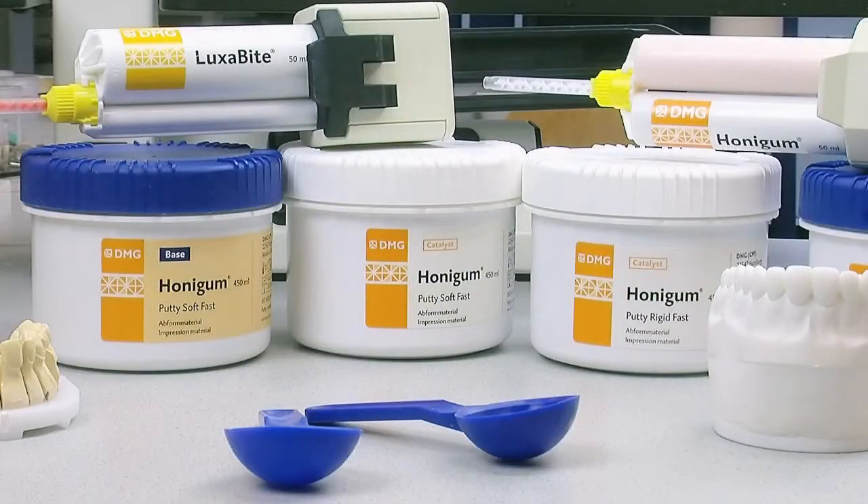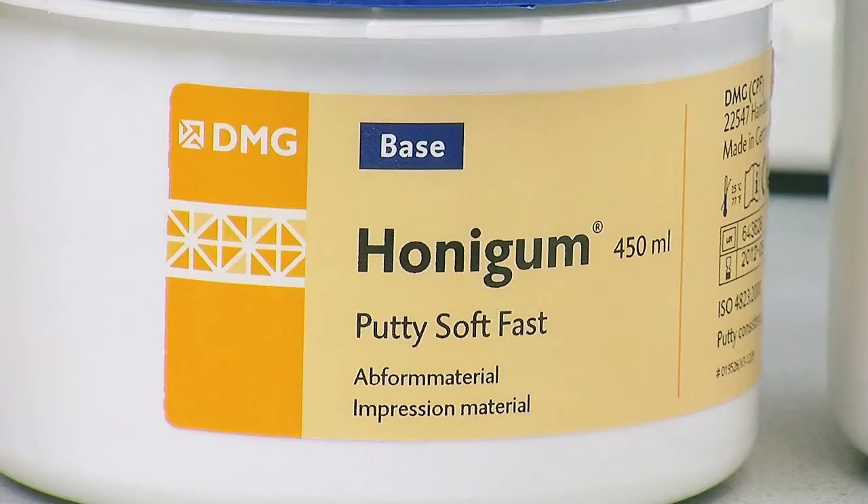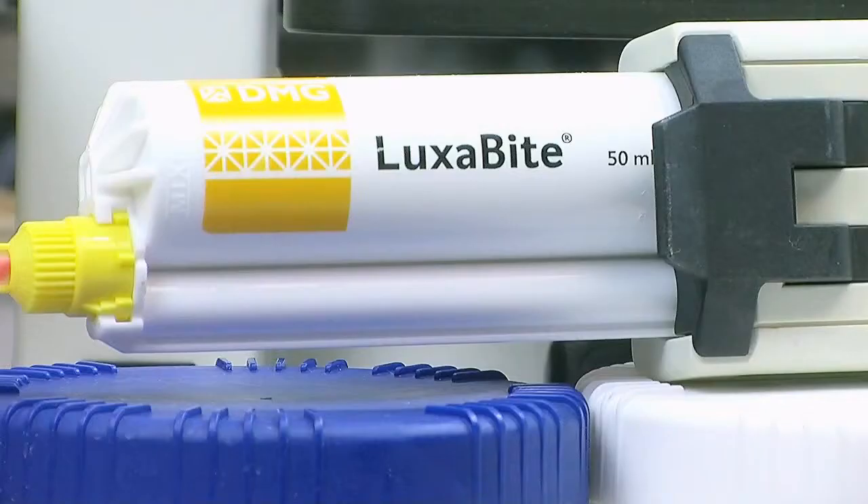We're going to be using the Honey Gum, we're going to use the Obite and Luxabite. We're going to show you how we transfer data using Luxabite jigs.